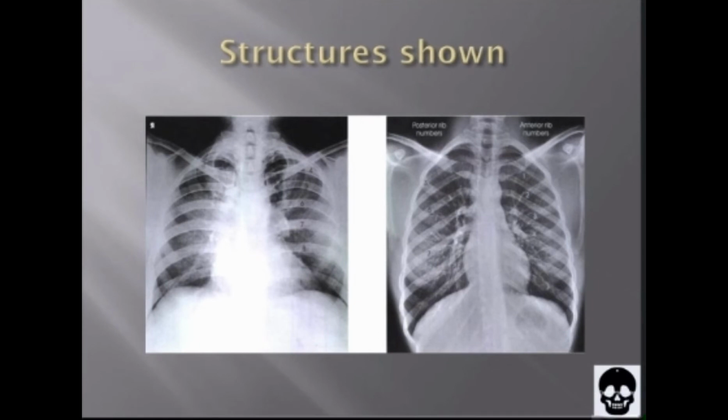Okay. We have here the anterior ribs, here the 1, 2, 3, 4, 5, 6. Then this is the posterior ribs here, 3, 5, 7. The PA projection best demonstrates the anterior ribs above the diaphragm. The posterior ribs will be seen. However, the anterior ribs will be demonstrated with greater detail since they lie closer to the IR.